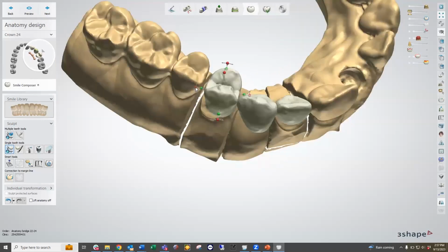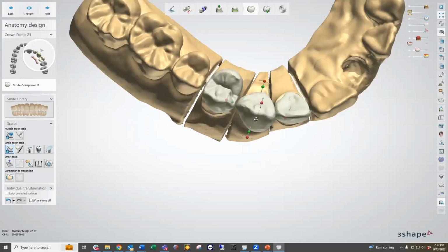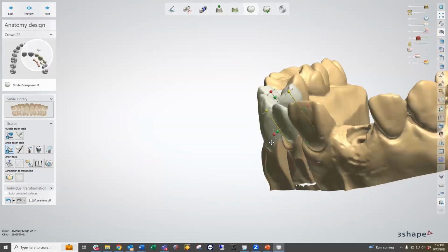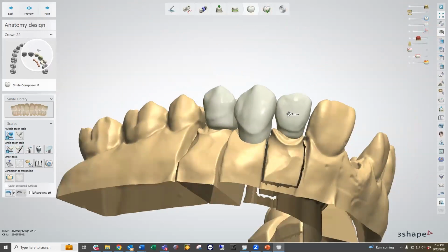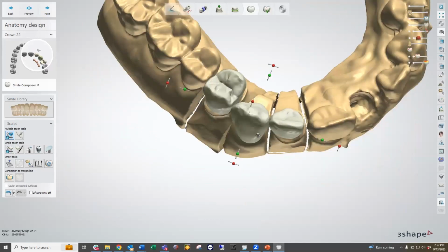And then I'm going to rotate this so it follows a little bit more in line with the arc that we have going on here. Same thing with this one. I'm going to bring it a little bit more mesially like that, and then bring distal out a little bit. Okay. And then we can formulate this one to be a little bit longer as well. All right. Once I've made those changes, it adapts those changes to the whole 3 units as a whole. So if I go back to my multiple teeth change, now they're going to keep those changes that we just encapsulated there. So I'm going to just make the necessary changes that we see here.